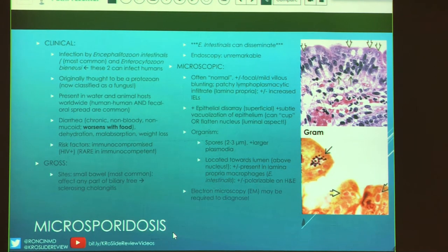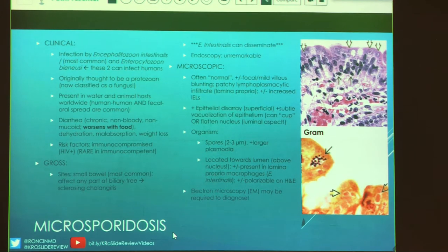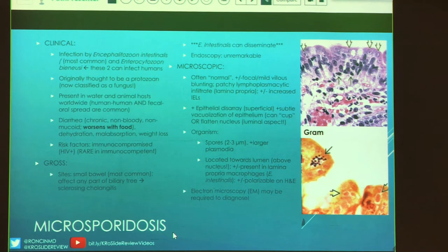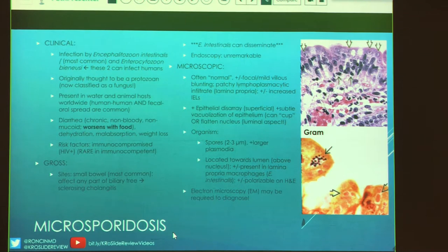Microsporidia — specifically Encephalitozoon intestinalis and E. bieneusi — are the two species that can impact humans. Originally thought to be protozoa, now classified as a fungus. Present in water and animal hosts; spread human-to-human via fecal-oral route. They cause chronic, non-bloody, non-mucoid diarrhea that gets worse with food. Patients will be dehydrated, have malabsorption and weight loss. Risk factors: immunocompromised, particularly HIV-positive or transplant patients. These infections are rare in immunocompetent hosts, so if you see this with no history of immunocompromise, suggest additional testing.